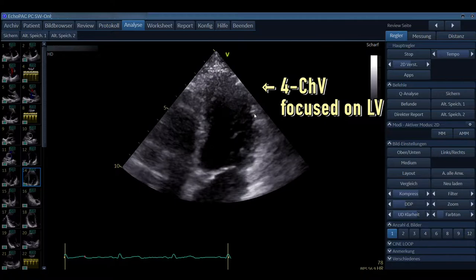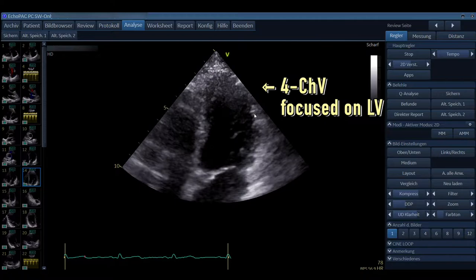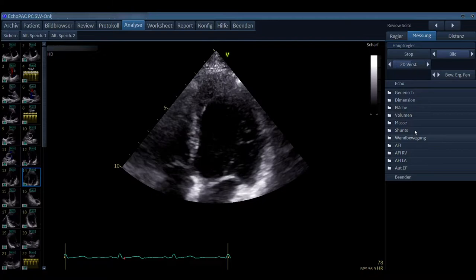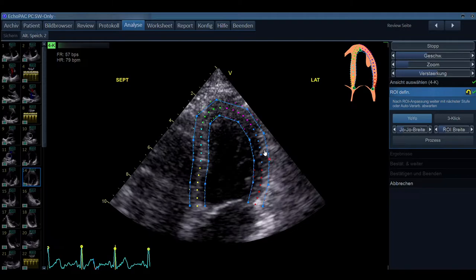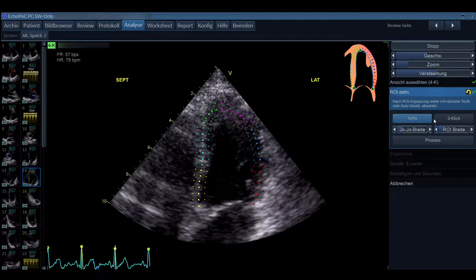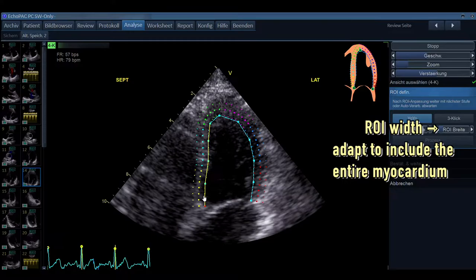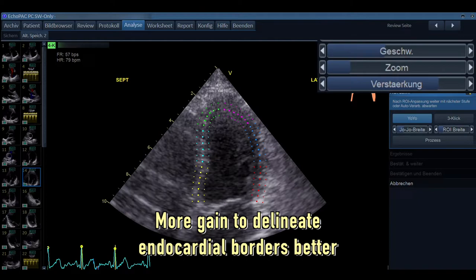You can delineate the endocardial borders quite nicely, but still we can adjust it a little bit. We again do the automatic imaging and it places this region of interest on our field of view. Now we can adjust the ROI width so that it is optimal. We can also simply turn up the gain a little bit to even delineate the endocardial borders better. So this is better for tracing and better to see.